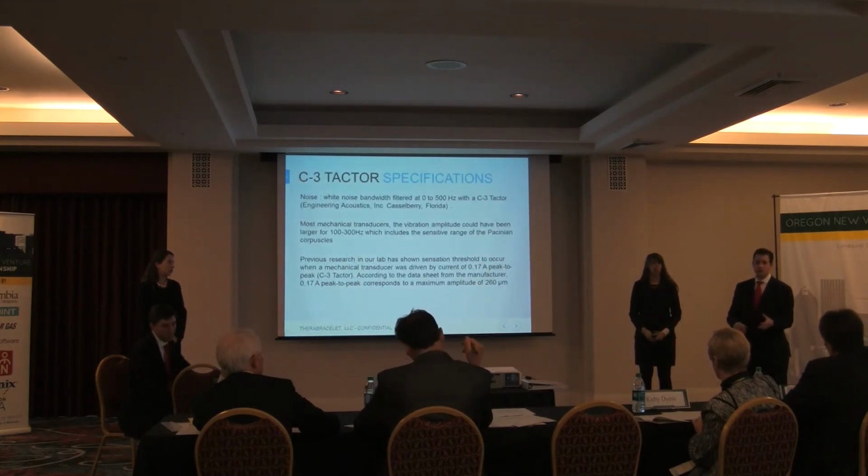So it's something that could have a charge for 3 to 4 days. Ideally, someone would take it off at night, put it on their nightstand and charge it, just like you would do with a Fitbit, for example.